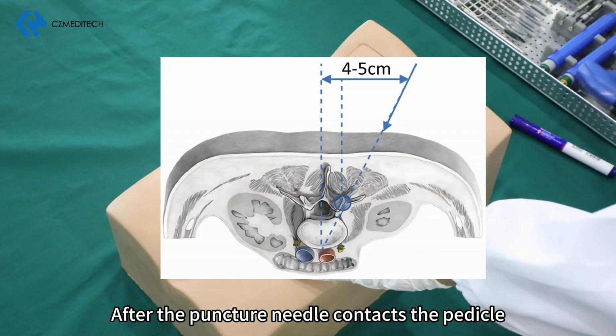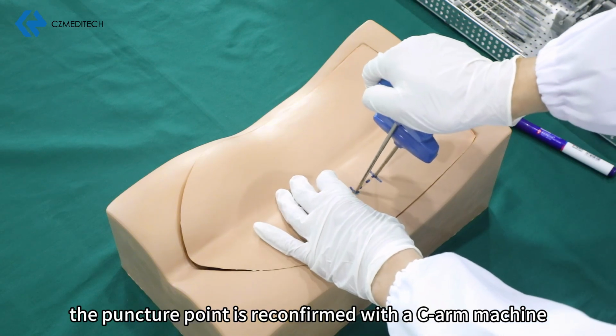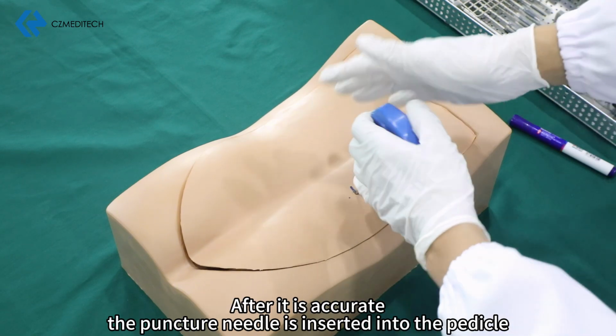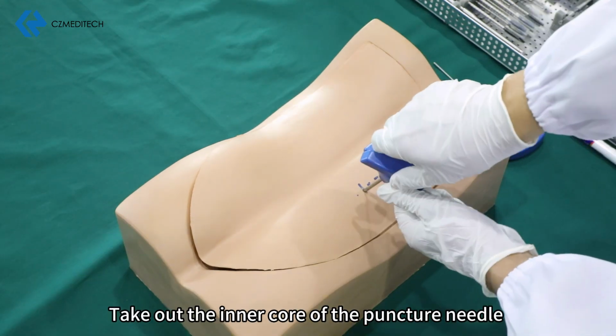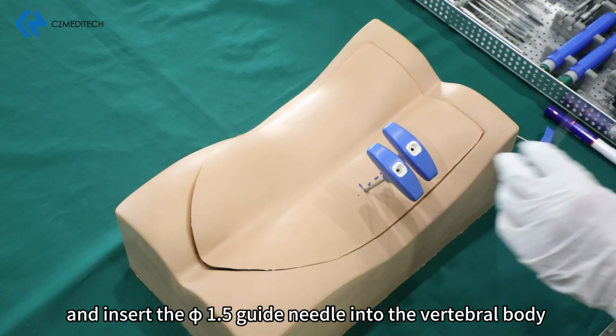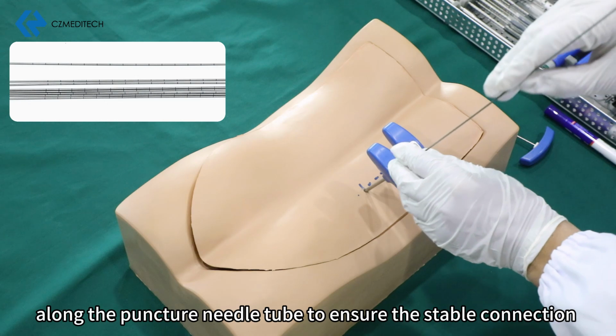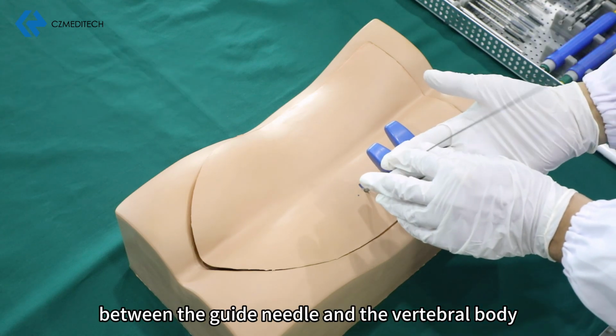After the puncture needle contacts the pedicle, the puncture point is reconfirmed with a CR machine. After it is accurate, the puncture needle is inserted into the pedicle. Take out the inner core of the puncture needle and insert the Phi 1.5 guide needle into the vertebral body along the puncture needle tube to ensure the stable connection between the guide needle and the vertebral body.